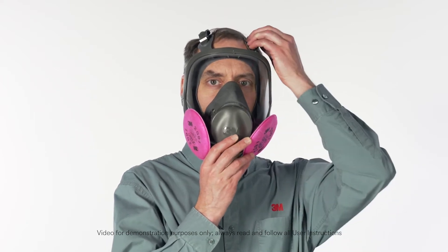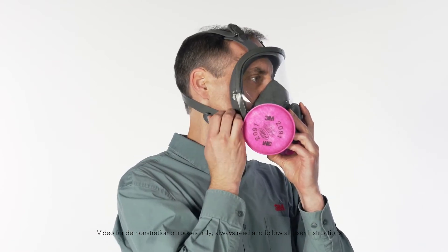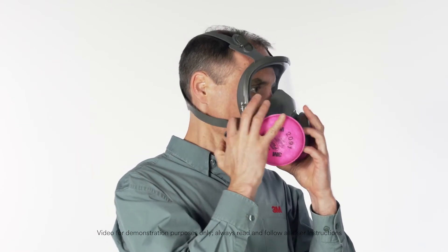To remove the respirator, first fully loosen all four head straps by lifting up on the buckles. Remove the respirator.